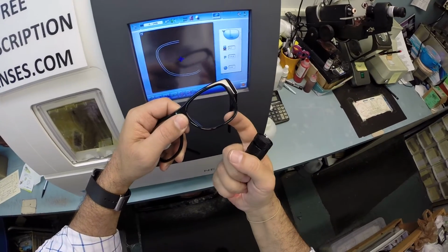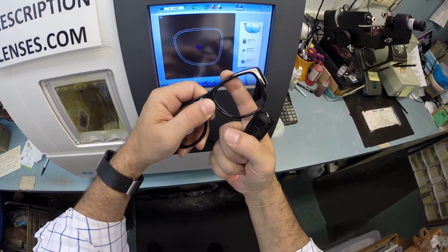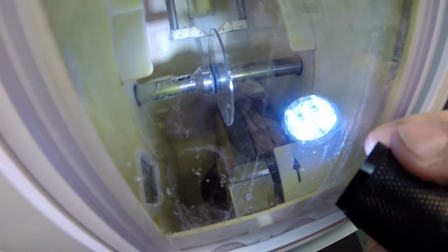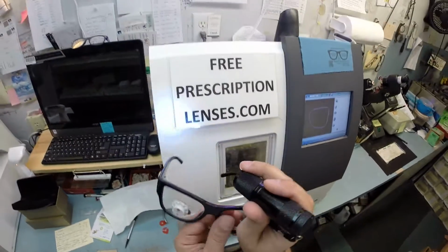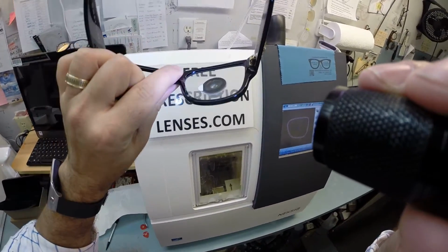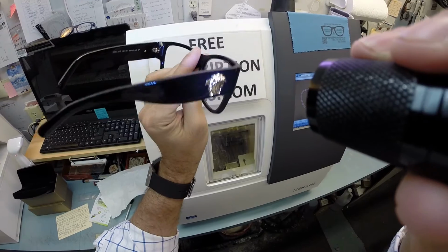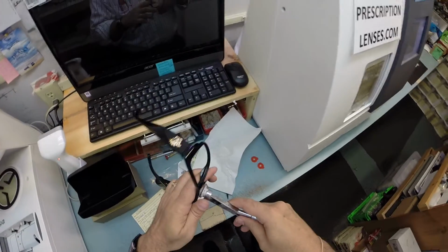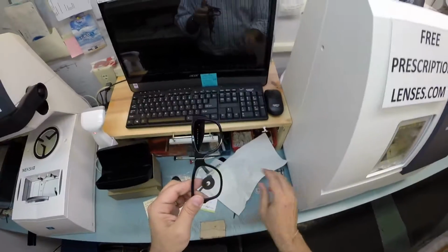And you can see as it's tracing, going around, my finger is the guide, making sure it's large enough to fit. And then the old carpenter saying, measure twice, cut once, to know exactly where to place the bevel so you have the least amount of edge thickness showing for the best cosmetic look, and you have no edge thickness whatsoever. Very well made pair.